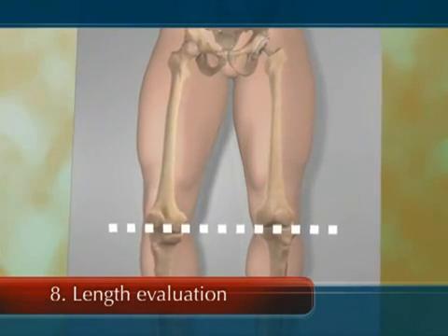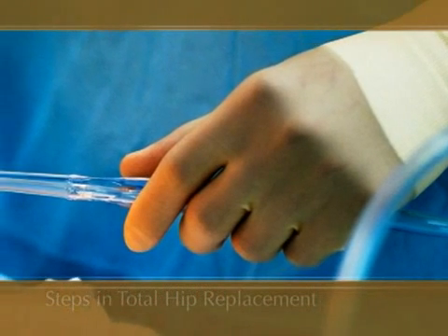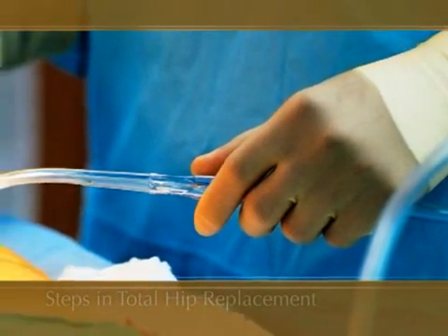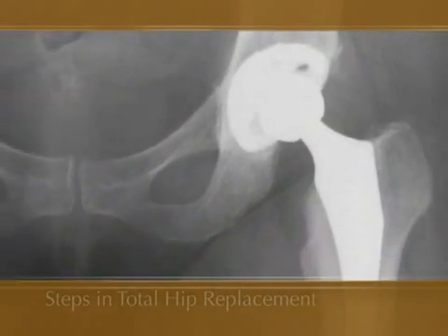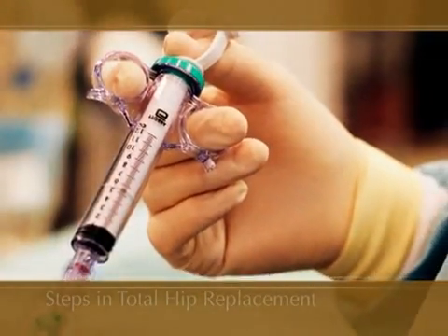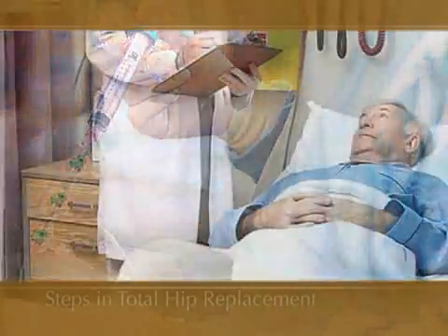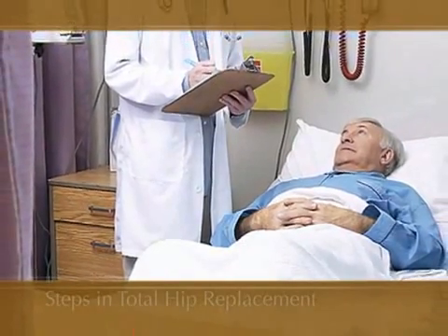The new implants will replicate your hip joint. Your physician will rinse out debris from the hip joint with sterile fluid, and then close the wound in layers with stitches and/or staples. A plastic drain may be placed in your hip and removed later. The purpose of the drain is to remove blood from the inside of the joint and tissues that might accumulate in the area after surgery. When you awaken from surgery, you will be in the recovery room.